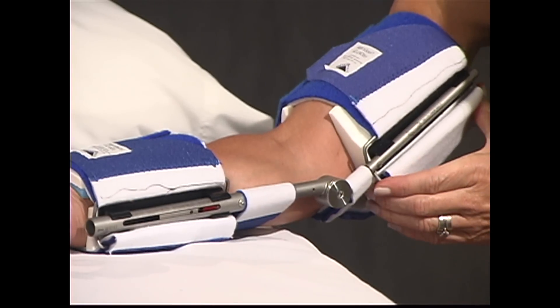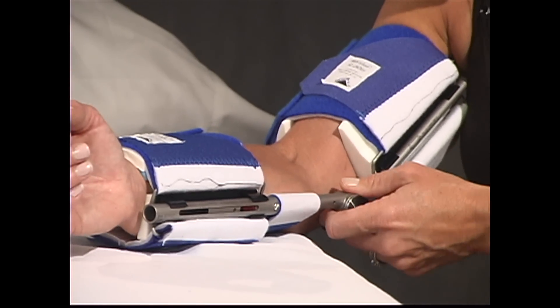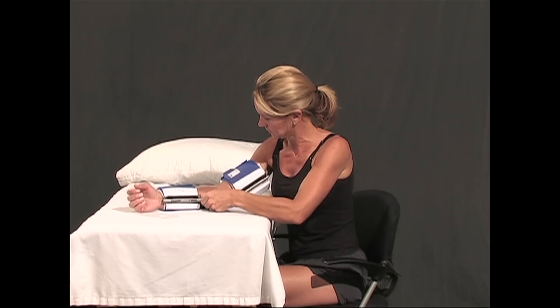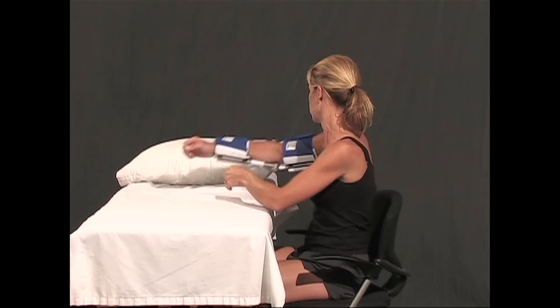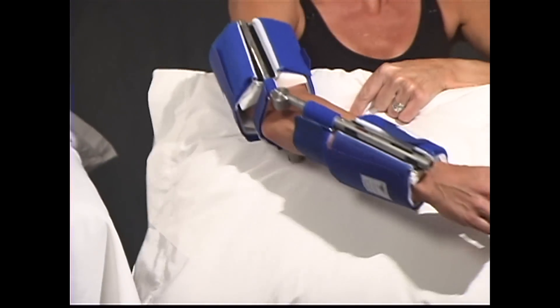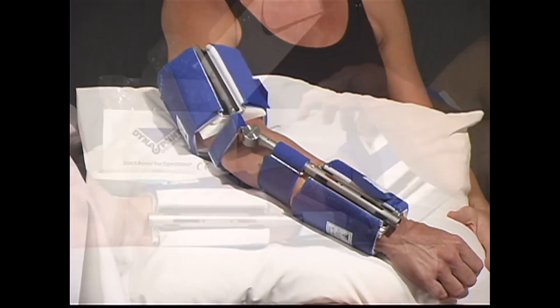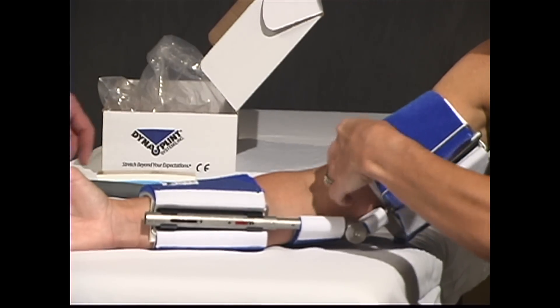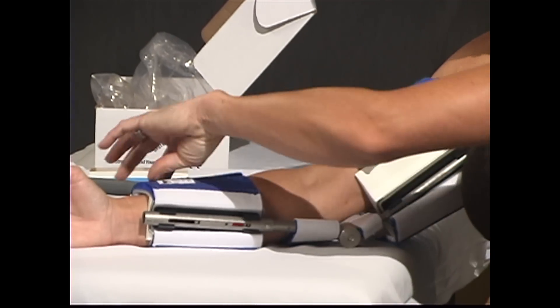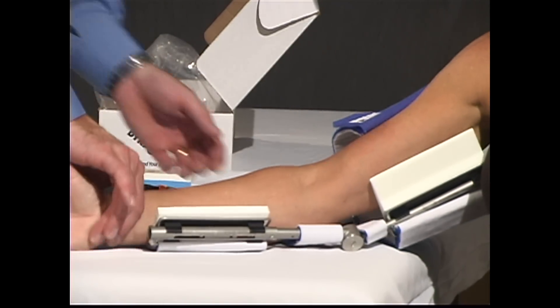You should be inactive and relaxed while wearing the DynaSplint system. The arm should not hang down. The most comfortable position is to sleep with the upper arm supported by a pillow, or sit with the arm supported so it's level with the heart. Do not block the lower arm from continuing to straighten. To remove your elbow extension DynaSplint, unfasten the top of the forearm cuff and the front of the upper arm cuff, then slide your arm out of the unit.